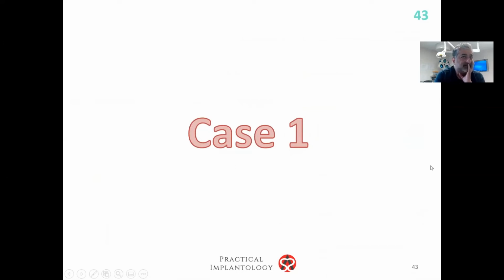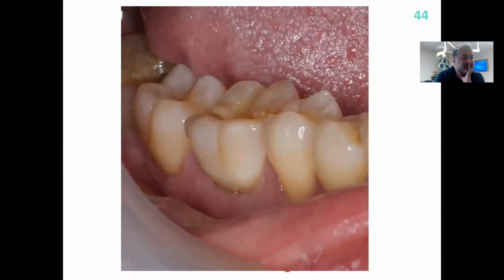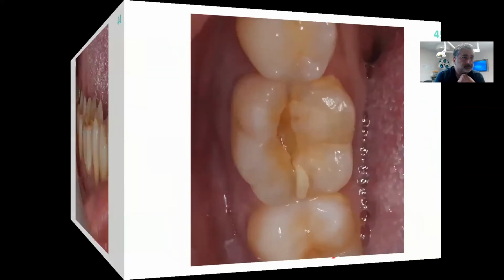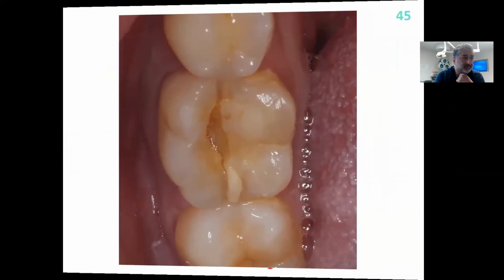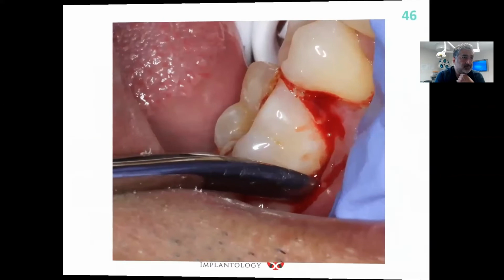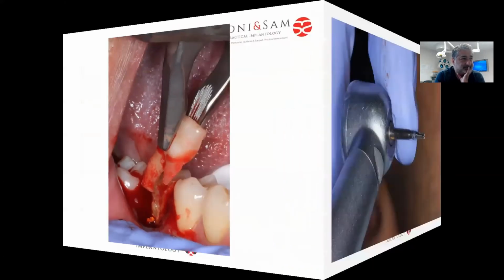So we go into some cases now. Case 1, with a vertical fracture on this 6 molar. I was going to place an implant in there, but still you could learn how to do part 1. You can see that vertical fracture. No, it cannot be saved. It's going to come out. I took the loose bit of root out very carefully, and you must pay attention to this case because there'll be some issues later.